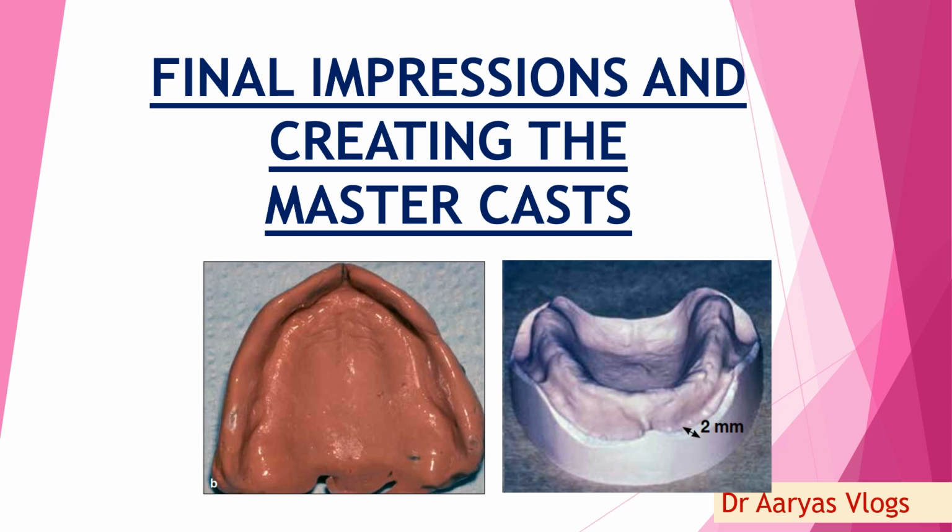Today I am going to discuss a very important topic in the field of dentistry, that is final impressions and creating the master cast. I hope you have all liked the previous video, that is fabrication of custom tray. After that step we will move on to the final impression procedure. So let's begin.